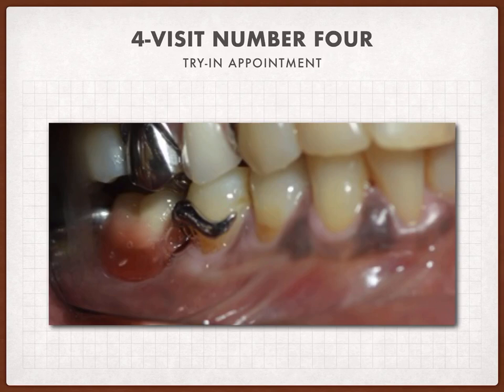After this procedure, when the lab has arranged the teeth on the metal framework, he will send us the metal framework with the teeth on it to act like the original denture or the final denture, but with the wax attaching the teeth to the metal framework, not the acrylic. In this appointment, we will try this thing inside the patient's mouth, so we call it a try-in appointment, in which we will do two things.